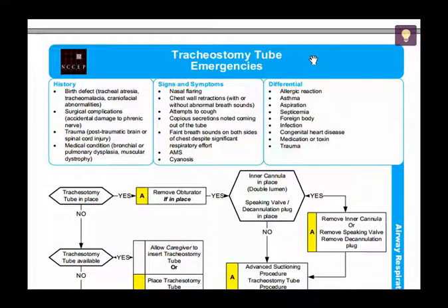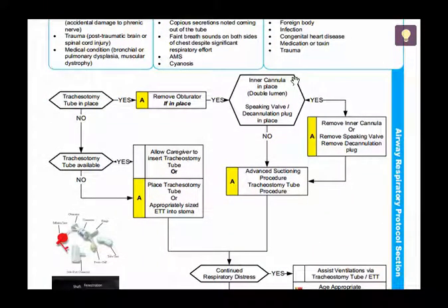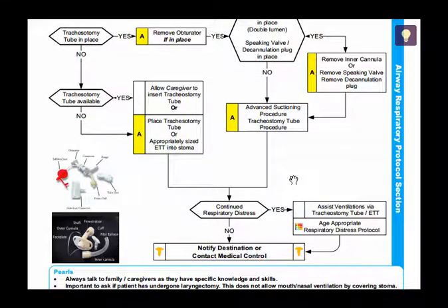Next up is tracheostomy tube emergencies. A lot of what's listed down here goes to the advanced EMT level, but for everyone to review are the pictures listed here that show all of the equipment: the obturator, the cannula, the flange, where there's a balloon, and some do not have a balloon on it. It's a good idea to familiarize yourself with all the hardware with one of these, because sometimes when you get to your patient, some of the parts are missing. Or sometimes somebody has shoved an inner cannula in or displaced something that may be a part of it. So just look at this, and look for what's missing in case there's an emergency.